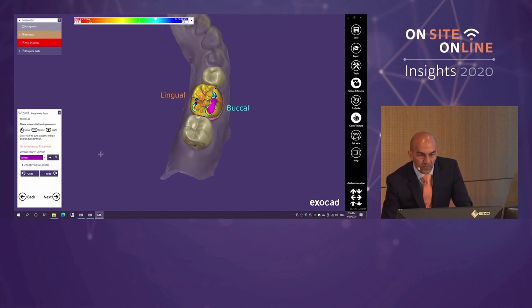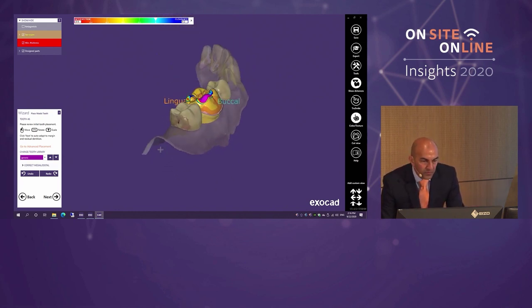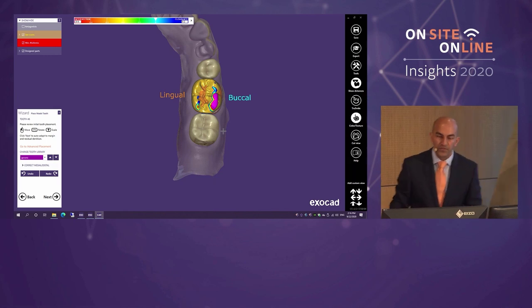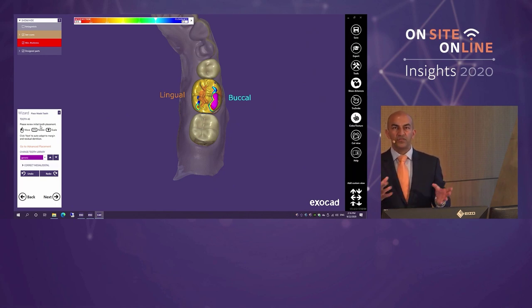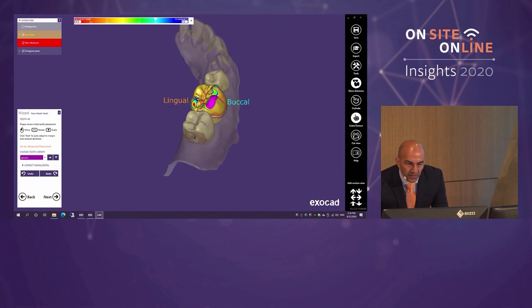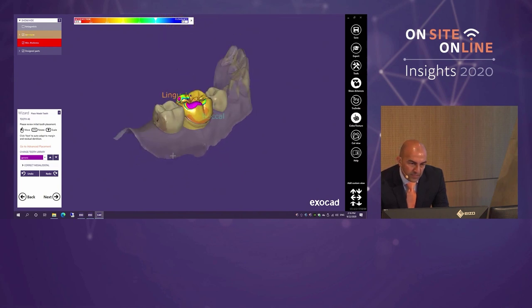Personally I use the generic library most and don't tend to change it, but it's useful for some practitioners to have multiple libraries. This is an important step where we help the software position the proposed restoration. Instructions are on the left side in small print — that's so the patient sitting next to you isn't reading them. I hold Shift to scale the restoration bigger, use Control to rotate and tilt, and position it over the quite wide preparation, moving the tooth buccally.